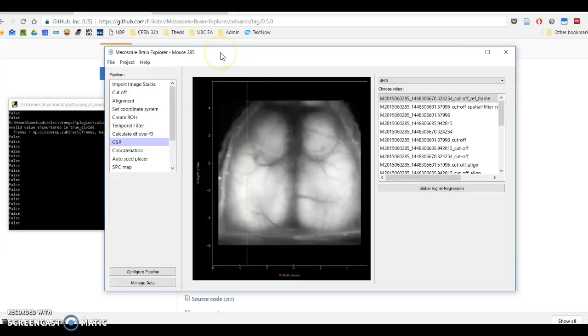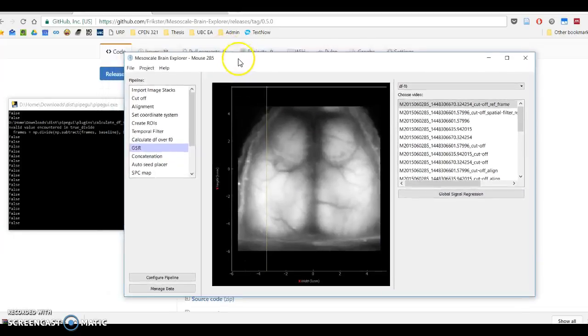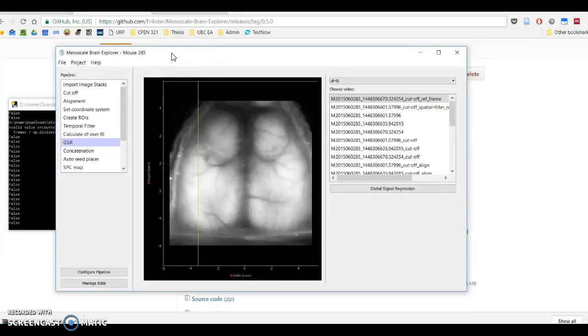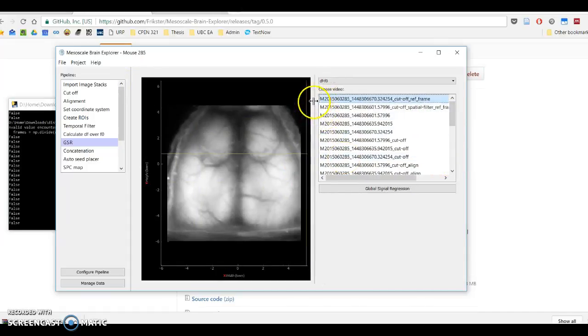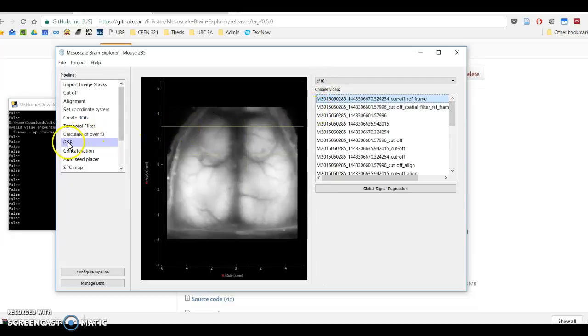So if you want to remove that, your end data might look nicer, but you might be removing something that's actually pivotal to what you're trying to study. However, you might not. There are arguments both ways. So just so you know, using GSR, there is controversy to that.